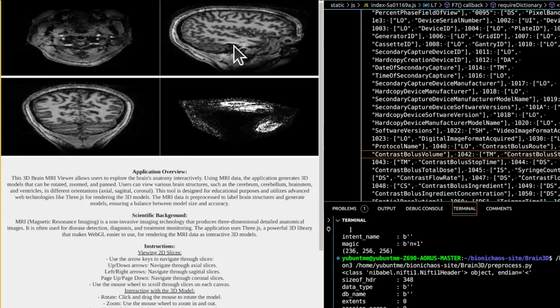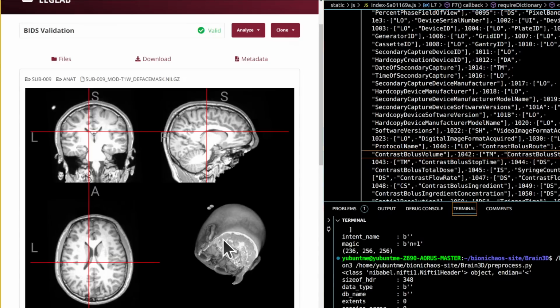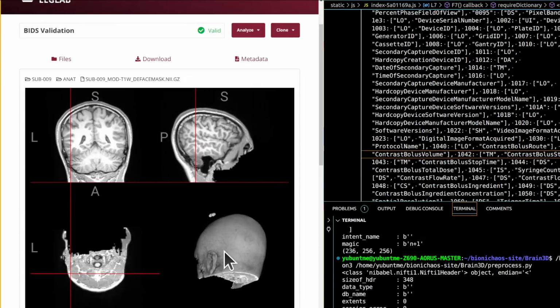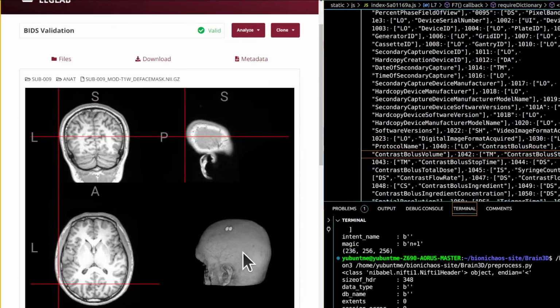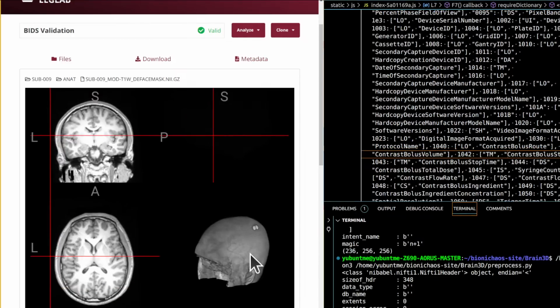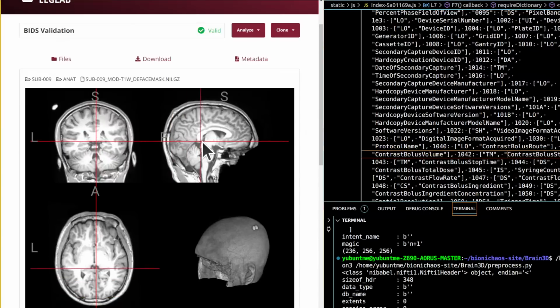These technologies work together to handle large datasets, provide fast rendering, and allow for smooth user interactions. If you are looking to implement similar functionality, consider using libraries such as cornerstone.js, NiiVue.js, and leveraging WebAssembly for performance-critical tasks. Additionally, ensure your data is compressed and use streaming techniques to improve load times and interactivity.